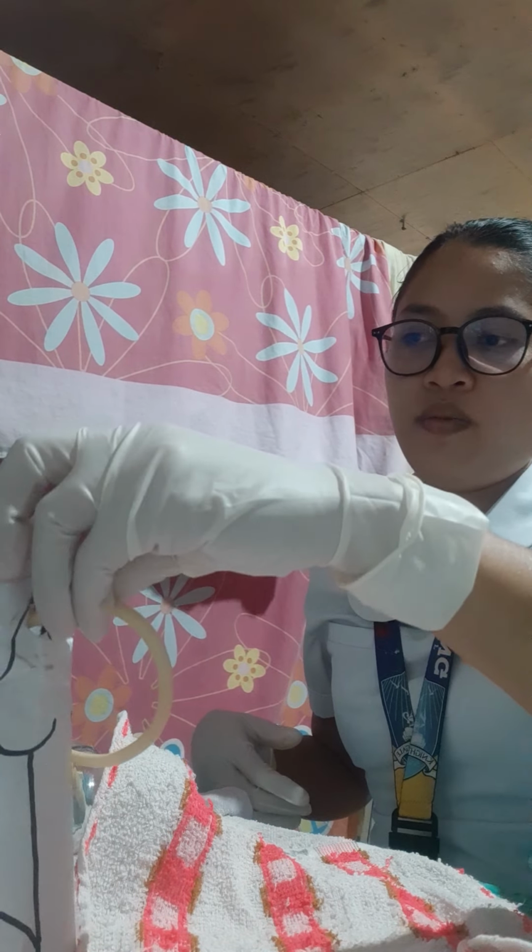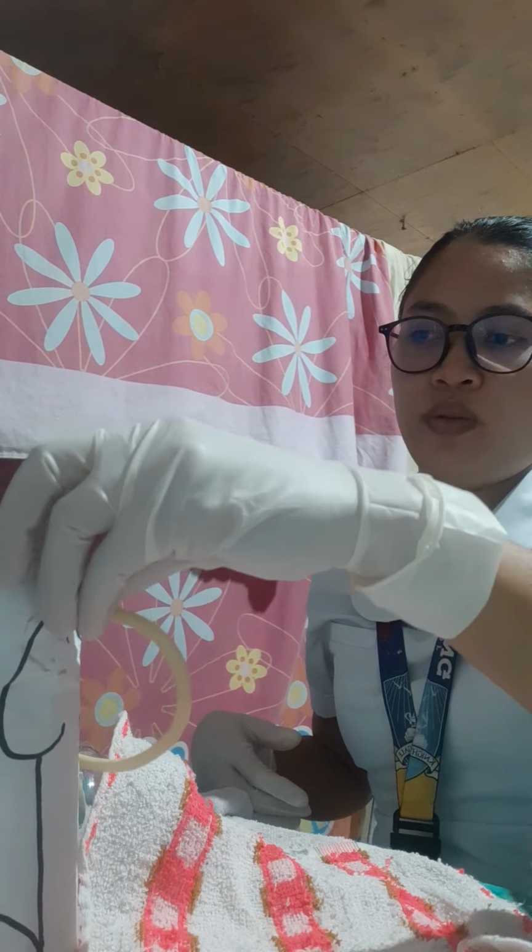Next, we're going to replace the adhesive tape that anchors the catheter to the client as necessary. Then we're going to remove the residue from the skin.